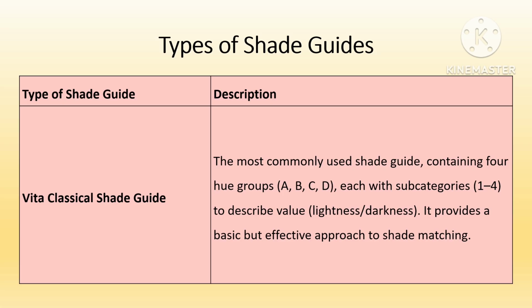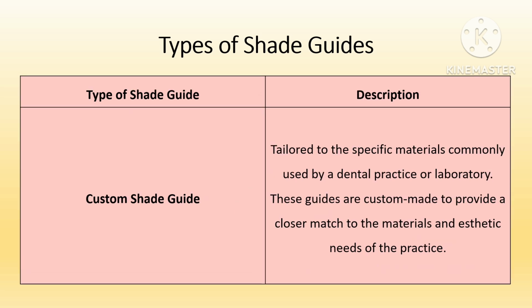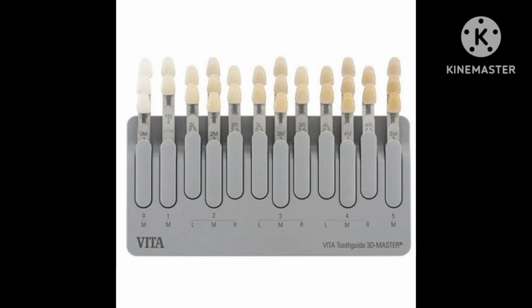The next guide is the Vita 3D Master Shade Guide. It was introduced to overcome the limitations of the Vita Classical system, which had less precision for advanced aesthetic cases, and also it does not account for brightness as comprehensively as modern guides.